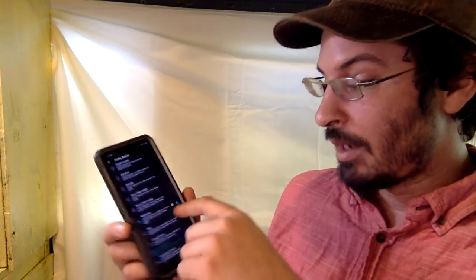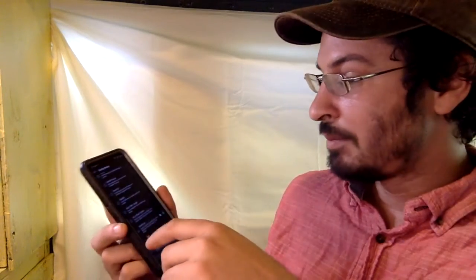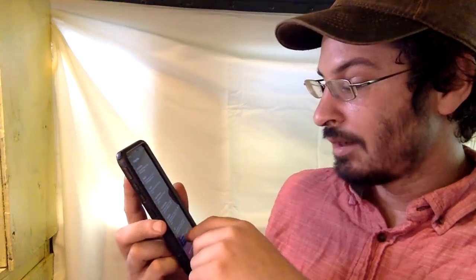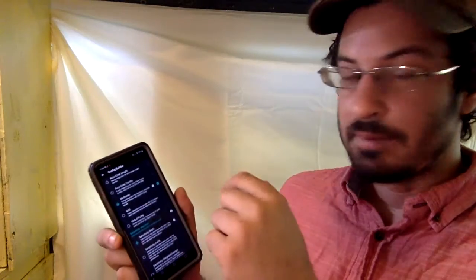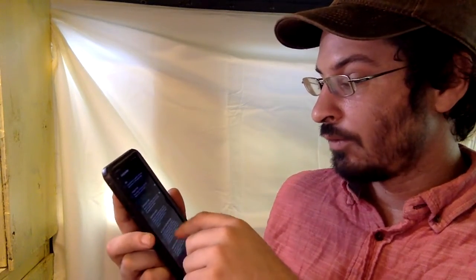You have your pumps here. Omnipod's not listed because I don't have the Omnipod branch, but you've got Dana R, Dana RS, Accu-Chek, Insight and Combo, Medtronic, and you can also use this before you get your pump with MDI, and it will tell you how much insulin to take with open loop.